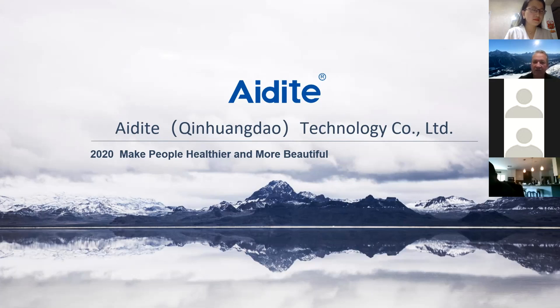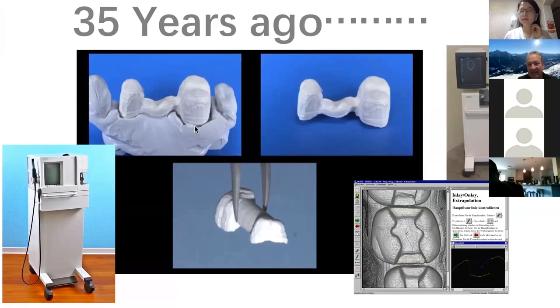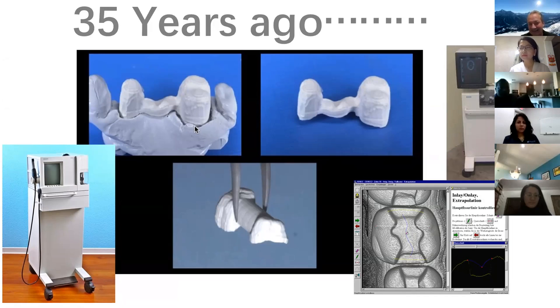About 35 years ago, I was part of Sirona. At that time it was Siemens. Five of us were involved in developing the CEREC system for the dental laboratories, and we were working with the CEREC 2 machine. We started with Professor Mörmann with CEREC 1, and this was the first ever milled bridge on a CEREC machine. I had designed this 35 years ago, and you see the connector was in the wrong place because the software was only for inlays, and we tried to design a bridge with this software. And you see the surface looks very strange, but that was the start. Everything was in 2D, and everybody was laughing at me. They said CAD/CAM will never happen.